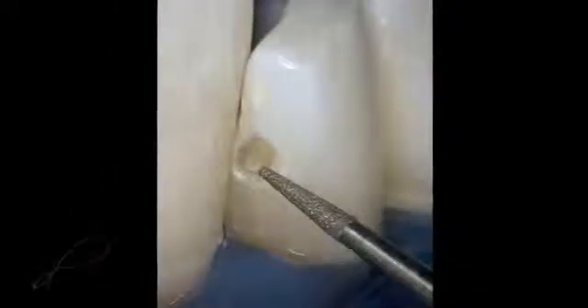An enamel bevel is indicated because it increases the surface area for end-on etching of the enamel rods for an increased etched surface, which results in a stronger enamel to resin bond, which increases the retention of the restoration and reduces marginal leakage and discoloration.